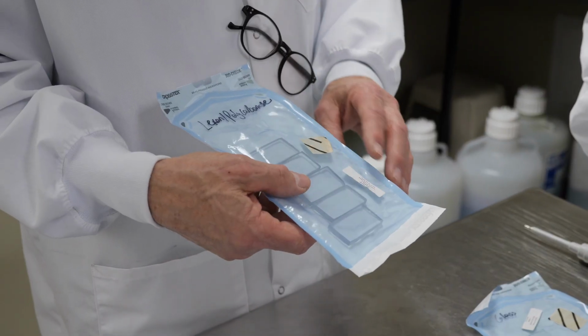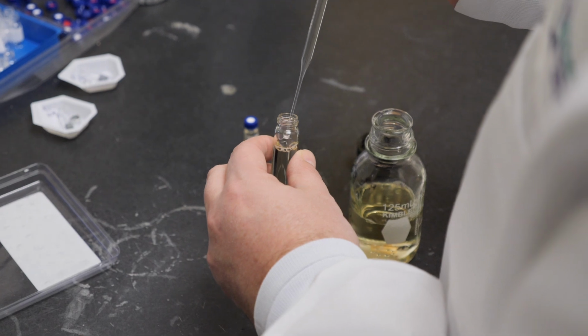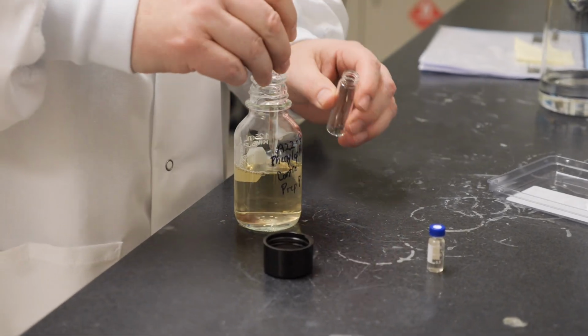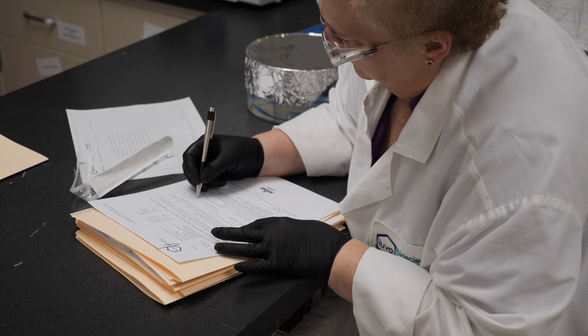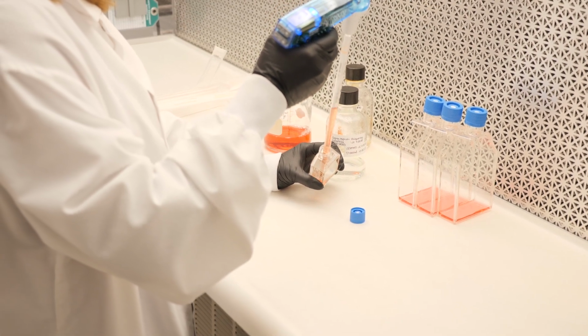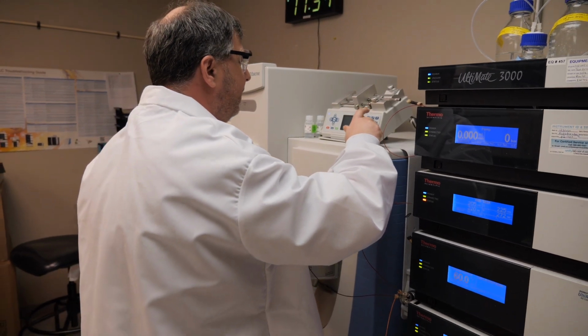clean manufacturing area. It is extremely important for customers to validate their products and their site, as this is an FDA requirement, a USP requirement. Each site is required to validate these particular disinfectants that they're going to use in their site. So per USP 1072, the requirement is that you validate, again, all of the cleaners and disinfectants you use in the facility to ensure that they work properly with the materials that are in your facility.